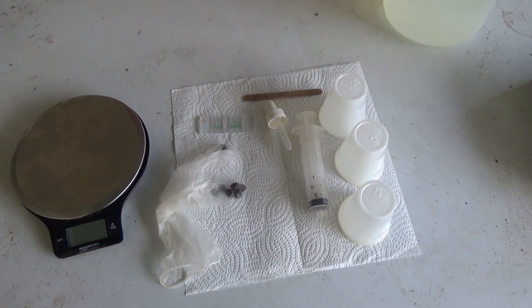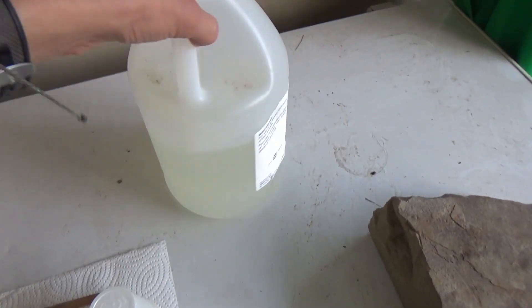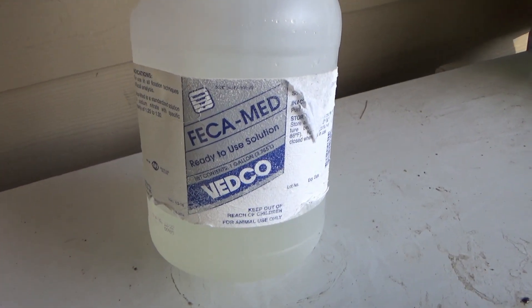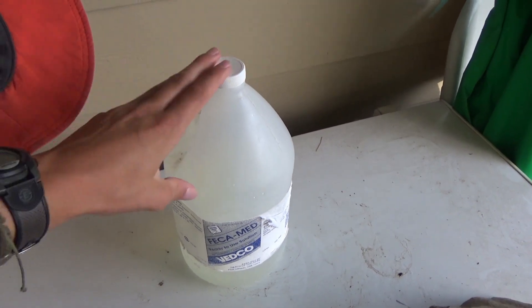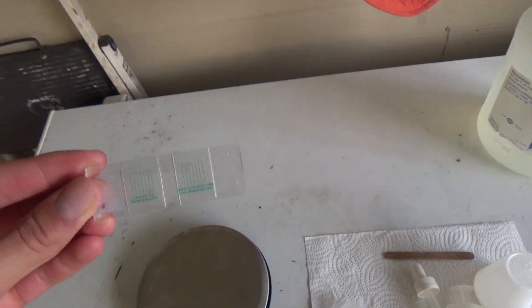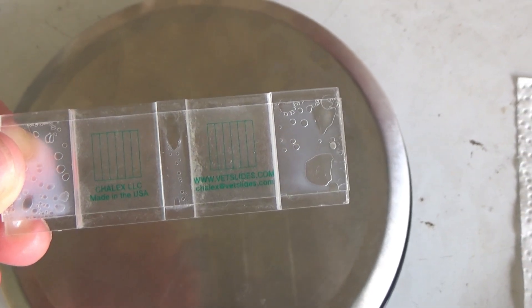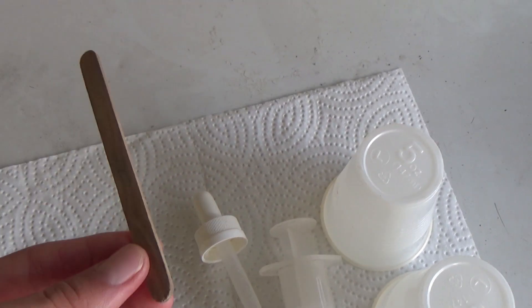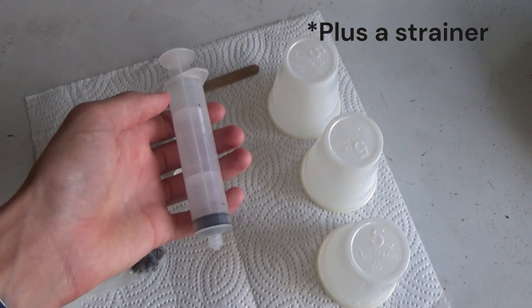Now that we've got our pellets here, I'll show you what you need to do the fecal test. You're going to need a flotation solution — I got this online, it's a whole gallon and it lasts literally forever. I do recommend getting pre-made flotation solution, although you can try to make your own. You're going to need a scale that can weigh in grams. You're going to need a McMaster slide — this is the most important thing you're going to need, because those chambers and lines are what you're going to use to measure the eggs, the amount of eggs in each gram. You're also going to need a mixing stick, a dropper or syringe to suck things up, and three cups throughout the whole process.